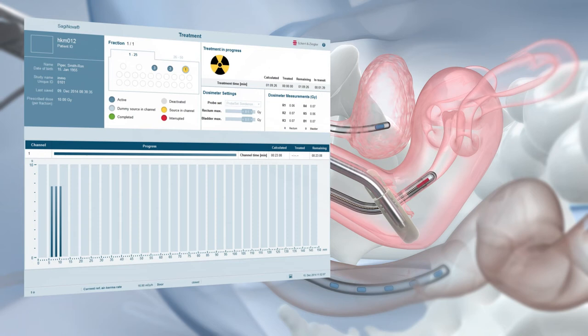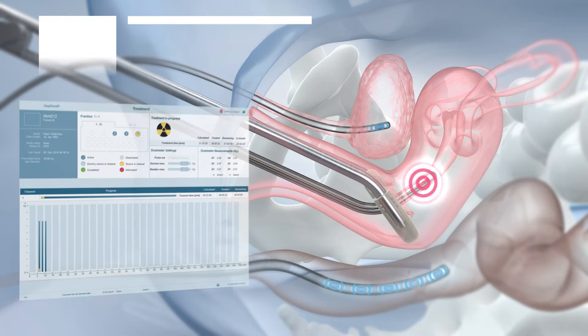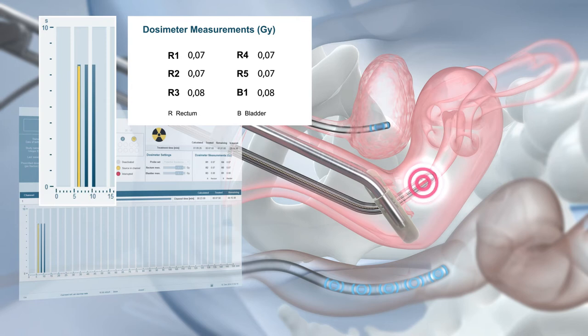The integrated in vivo dosimetry allows for real-time dose monitoring. Dose limit values can be defined via the Saginova treatment control software and warnings are displayed if bladder or rectum dose limits are exceeded. The complete data is integrated in the treatment report for convenient documentation.